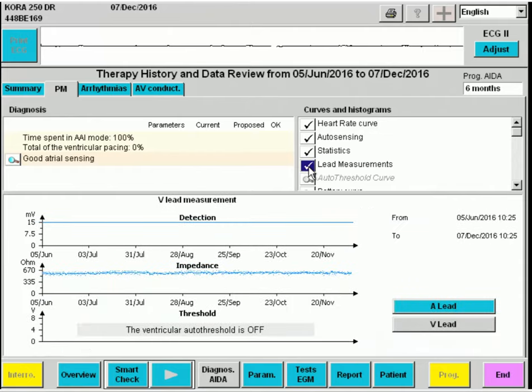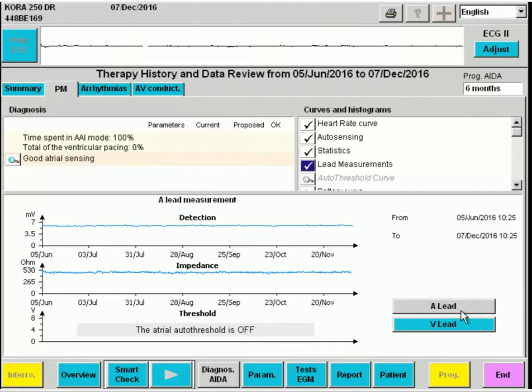Lead measurements here for the ventricle show sensed amplitudes, the impedances, and when automatic threshold testing is active, acquired values will also be displayed on the bottom curve. The same for the atrium: detection, impedance, and threshold.